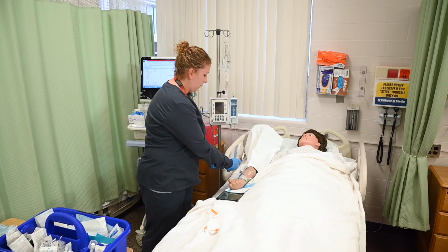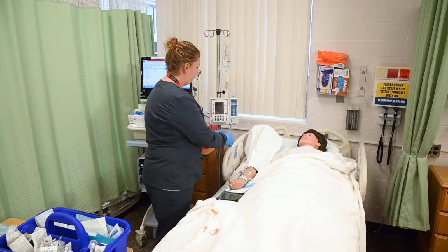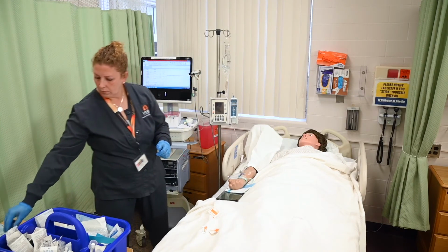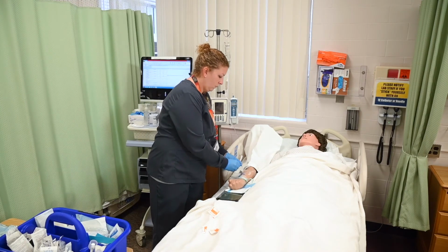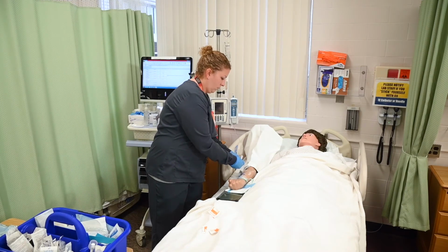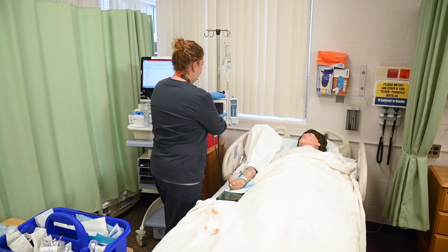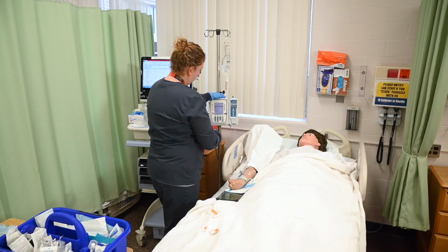After injecting the flush, disconnect the syringe and unclamp the line. Apply a new swab cap to the IV push injection port and restart the IV pump at the correct infusion rate. Sarah will stay with the patient for several minutes and observe for any adverse or allergic reaction.